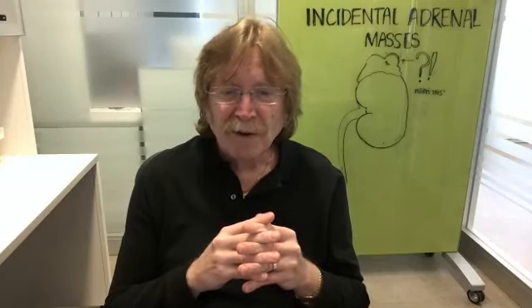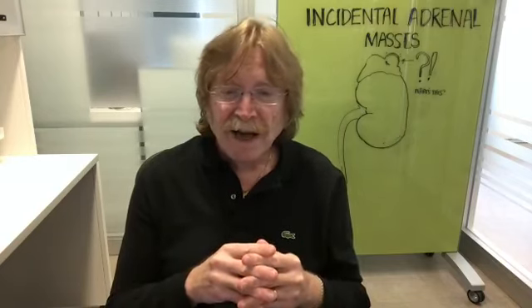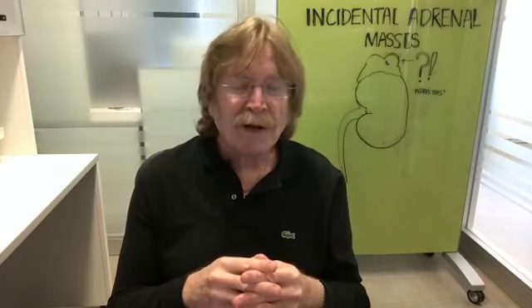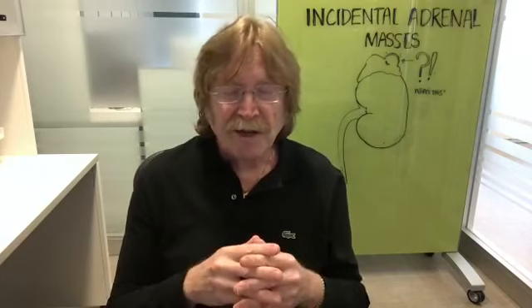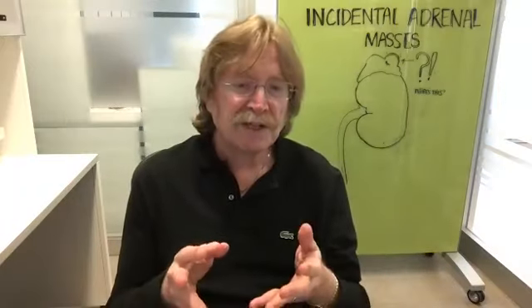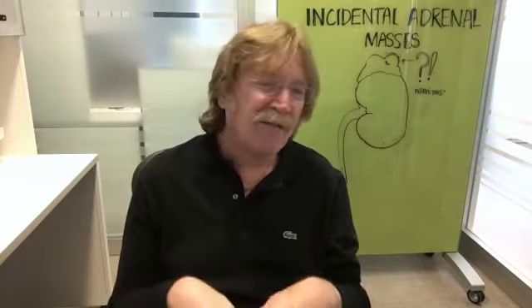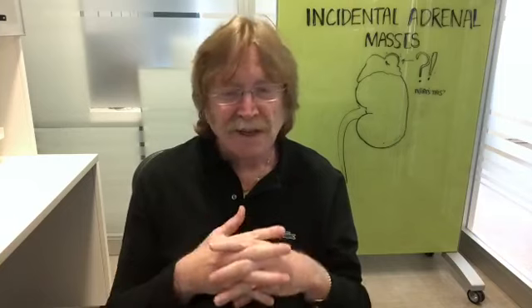Let me see now. Alberto has a question about PE studies, but you have to ask PE study questions when we're doing PEs. I have patients that will not fill the pulmonary arteries despite SVC right side. Okay, what's happening there? Well, it's obese patients, it's true, and it's patients who probably are Valsalving during the study, which young patients or obese patients tend to do more frequently. So with these large patients, have them breathe shallow. Don't have them take a deep breath. It's that deep breath in the Valsalva where unopacified blood from below comes up into the IVC, and that's what's giving you your problem.